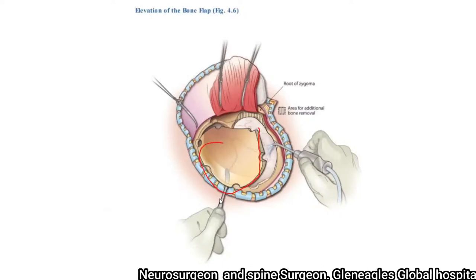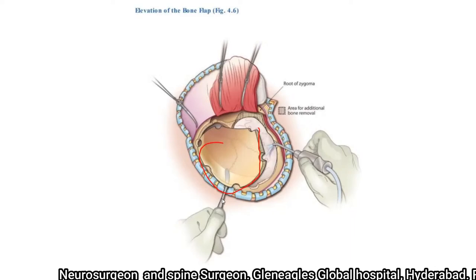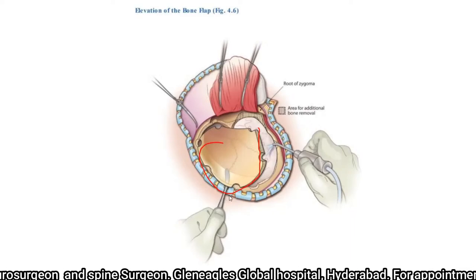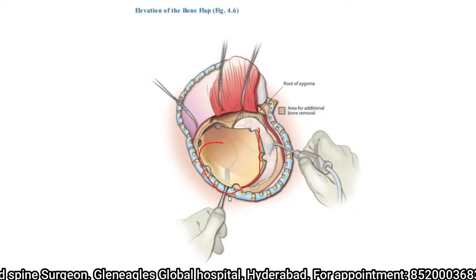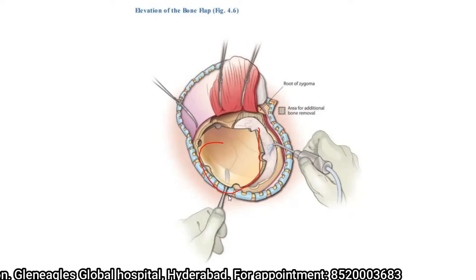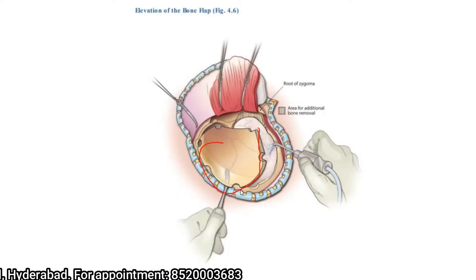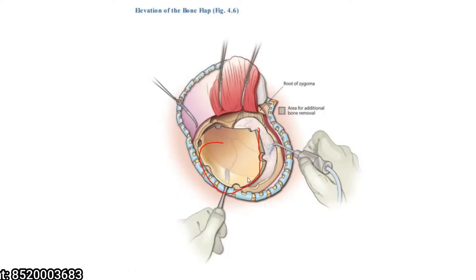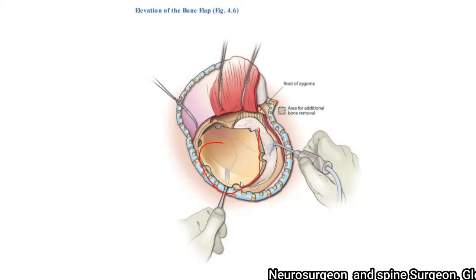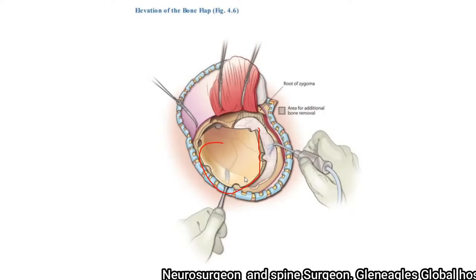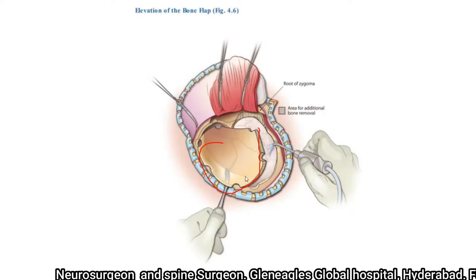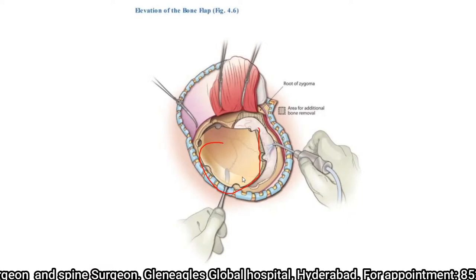A periosteal elevator or similar tool is introduced along the posterior edge of the craniotomy and used to elevate the bone from the underlying dura. This bone is placed in antibiotic-soaked saline if you are planning to store it in the abdomen. If you are planning to preserve it outside the body, hand it over to your assistant for the appropriate preserving technique.